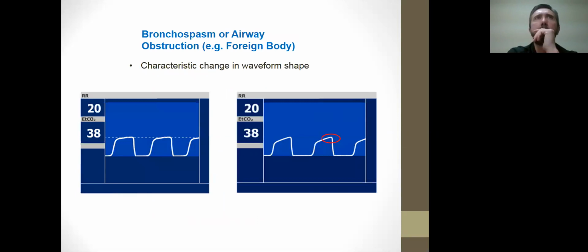Now, bronchial spasms here, or alveolar sloping, as I was just mentioning, the end-tidal CO2 monitoring on a non-intubated patient is an excellent way to assess the severity of asthma or COPD or any reactive airway disease and the effectiveness of your treatment. You know, bronchial spasms will produce that characteristic shark fin waveform as the patient has to struggle to exhale, creating that B to C upslope. Okay, the shape is caused by uneven alveolar emptying. Multiple studies have confirmed the sloping shape correlates to bronchial spasms and obstructive lung disease.